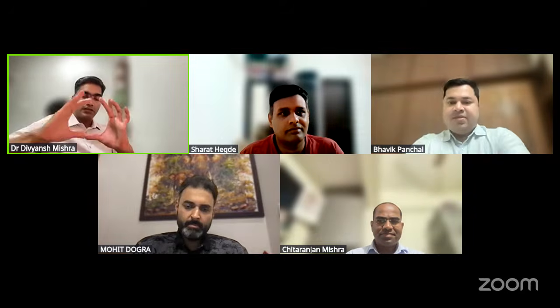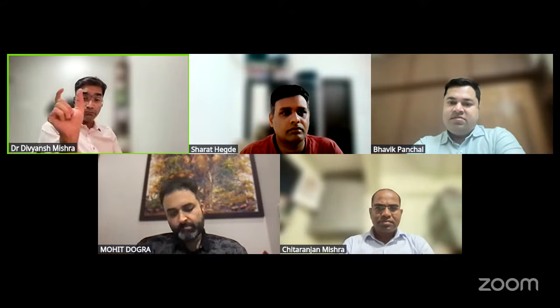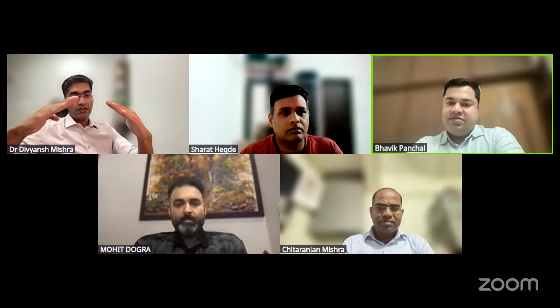Yeah, Dr. Divyansh. So Bhavik, one question to you. What are you suggesting, is it the minimum diameter or the maximum diameter? What is the size of the hole which you suggest? The maximum diameter can be wider, but the problem is they can have a high roof also. So for me, I would consider the minimum diameter for all the numbers which are suggested. For the minimum, less than 400 to 600, I'm talking about the minimum diameter, where the height of the foveal hole is. So the maximum can be anything, it doesn't matter.